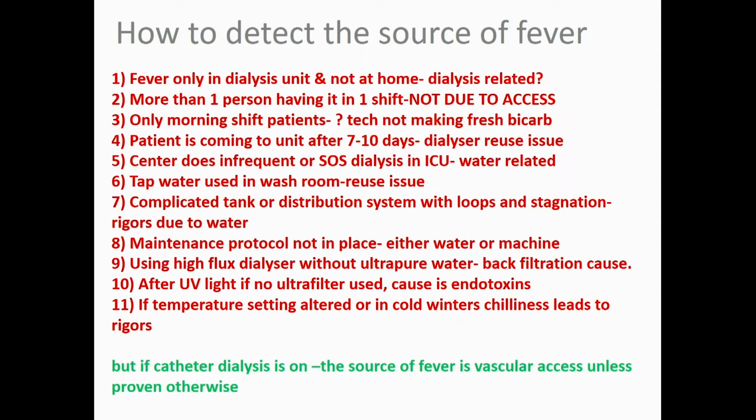In some centers, especially some of the charitable centers in the early morning shifts, the technician hasn't made fresh bicarbonate, he's using the night one, lazy or whatever you call it. Some patients had gone out of Mumbai, or where I practice, but have come after 7 to 10 days.